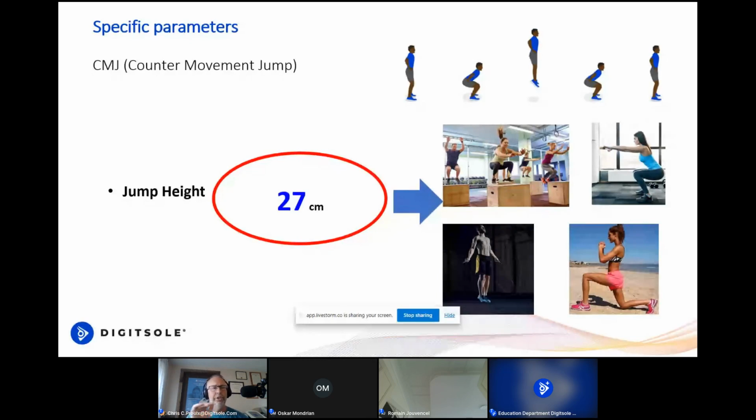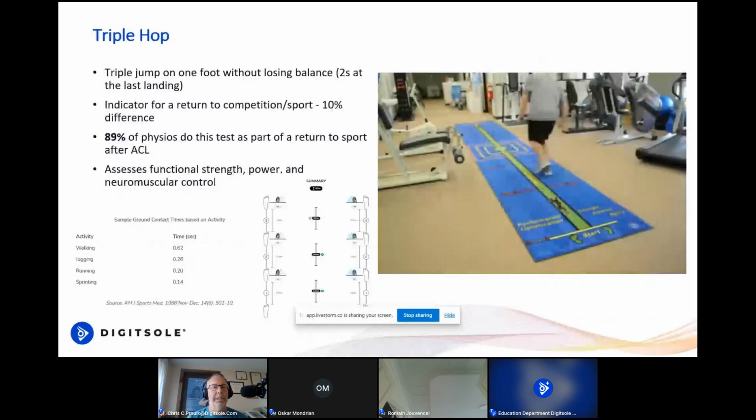We have data that shows that different athletes at different age levels and in different sports do have some variabilities, where I can actually show a patient that, oh, so you want to be a baseball player, here's the typical jump height that a baseball player is at that particular level of sport that they want to play, or basketball, or whatever sport it is. So it gives us their displacement, and that's the most basic characteristic that people have been measuring for a long period of time. But as we'll see in a moment here, we get a lot more detail regarding that.